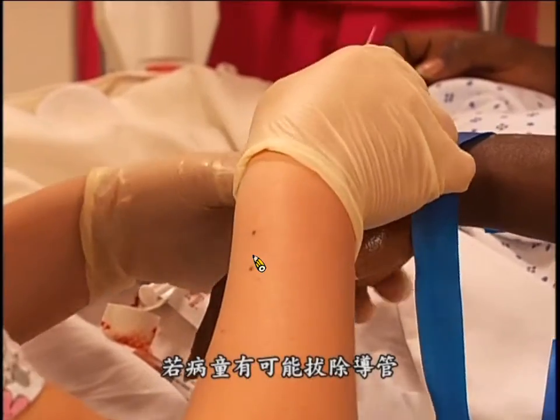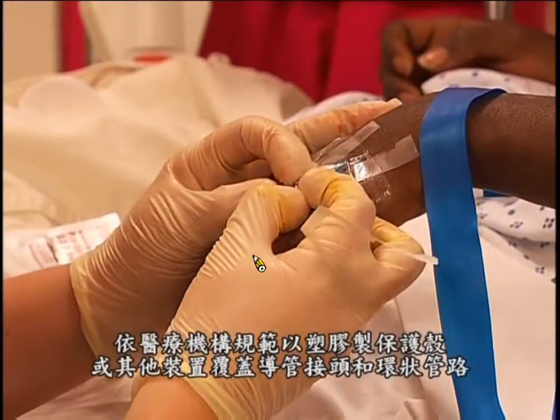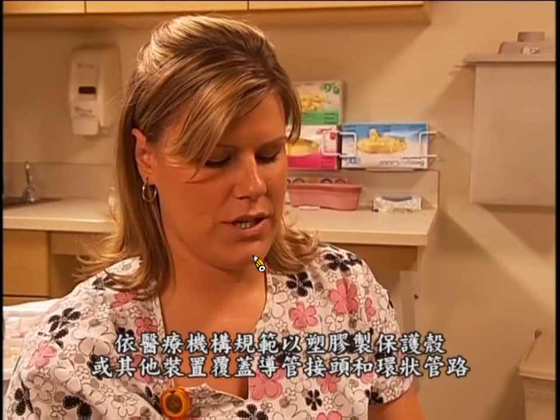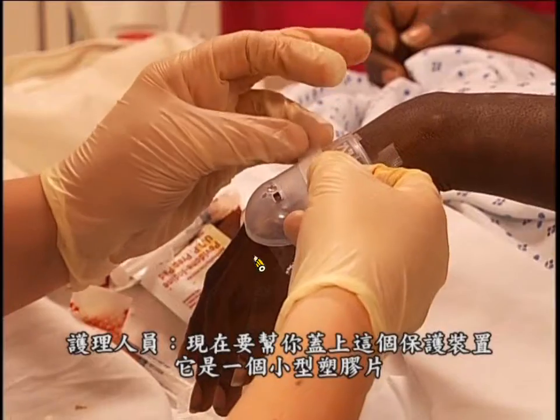If the child is likely to dislodge the catheter, cover the hub and looped tubing with a plastic shield, IV house, or other device, according to facility policy. I'll just put this house on there. It's just a little piece of plastic.